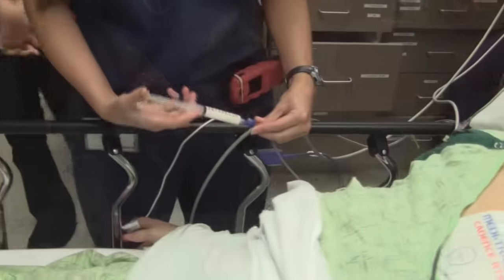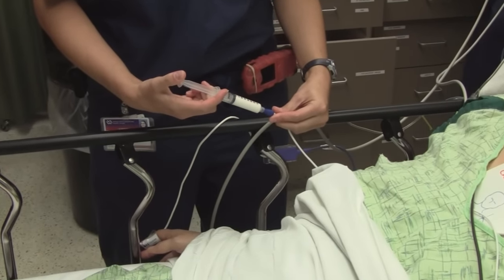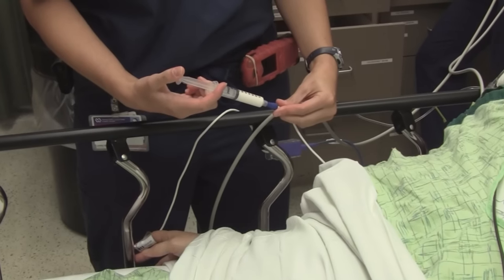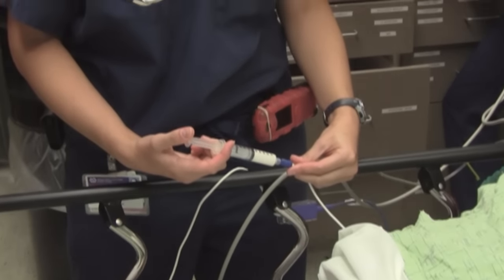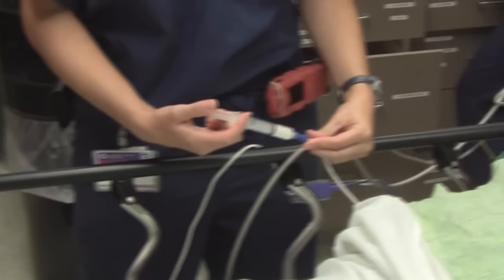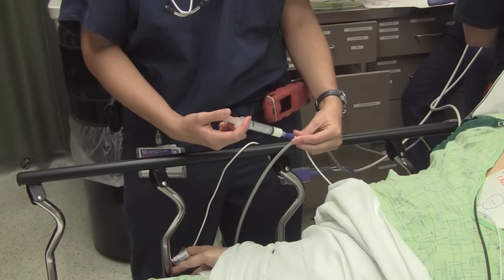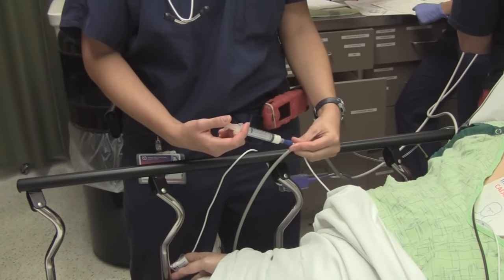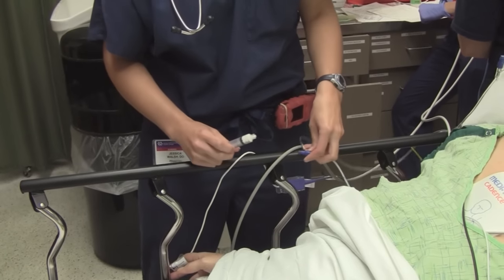All right, here we go — it's game time. Sleeping time. Jessica, tell me what you're doing. I'm going to give her one milligram per kilogram of propofol. When do I start the burning? Any moment. You may be one of the lucky ones that doesn't burn.